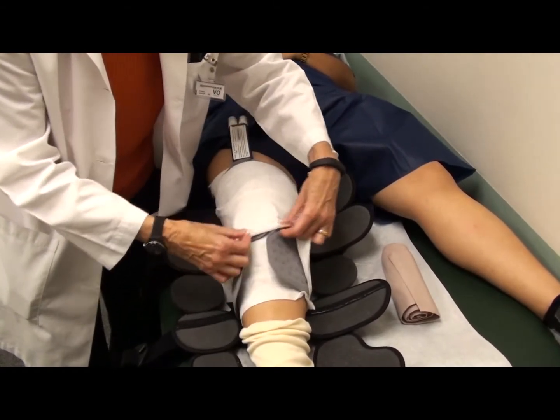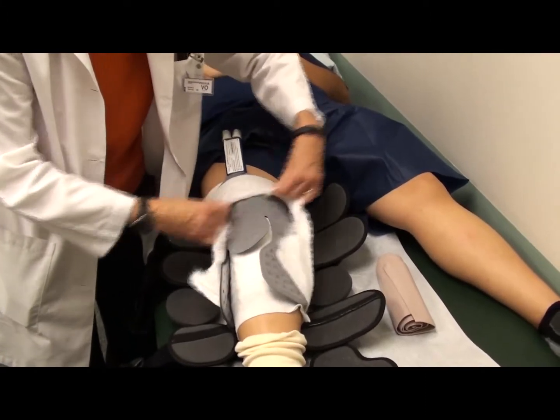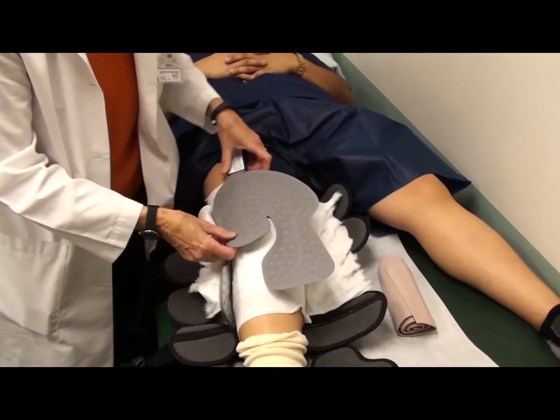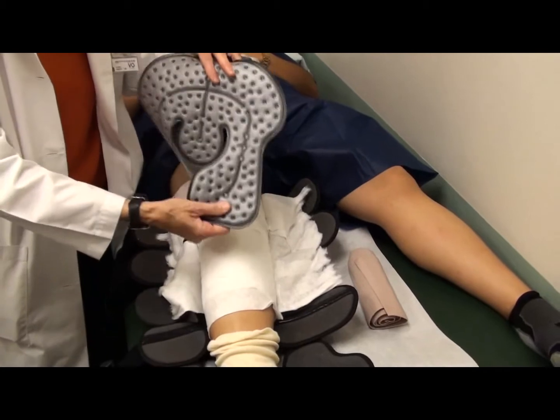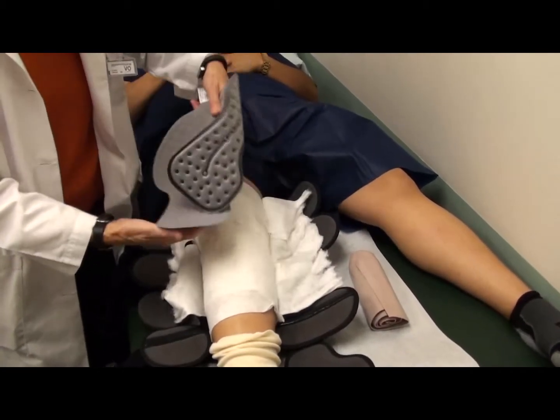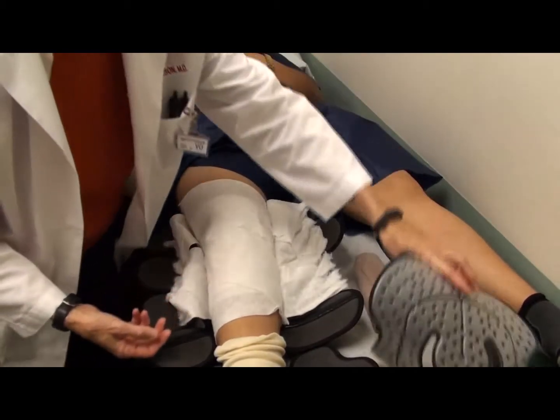Then you can just pull apart this little soft cotton padding that holds the cold therapy pad in place, if you have one. Now, as you've probably been told, the cold therapy unit's wonderful for reducing swelling, but the big point is that you don't want this touching the skin anywhere, or you can get a third-degree burn. So make sure there's a barrier between the pad and your skin always.